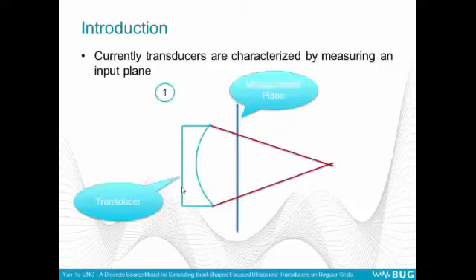Currently, transducers are characterized by measuring an input plane. The first case we have here is a single element transducer. The measurement plane would be right in front of it. And this is a very simple setup, very easy to do.